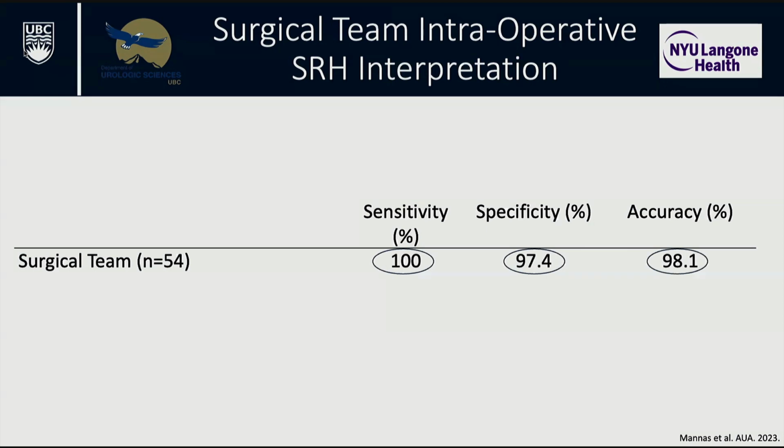One question. How did you assess that you did not miss any tumor? Yeah, so this is looking at the histology. So the biopsy is taken from SRH, then sent to pathology, and that was used as the ground truth. So it's 2 pathologist agreement on the H&E. Now, in terms of actually missing cancer in the patient, totally different discussion. Still have to review those results to see biochemical recurrence, MRI recurrence, positive repeat biopsies. Don't have the oncologic results. This is all just based on the actual pathology. So what was sent to the pathologist and compared side by side, that was these results.